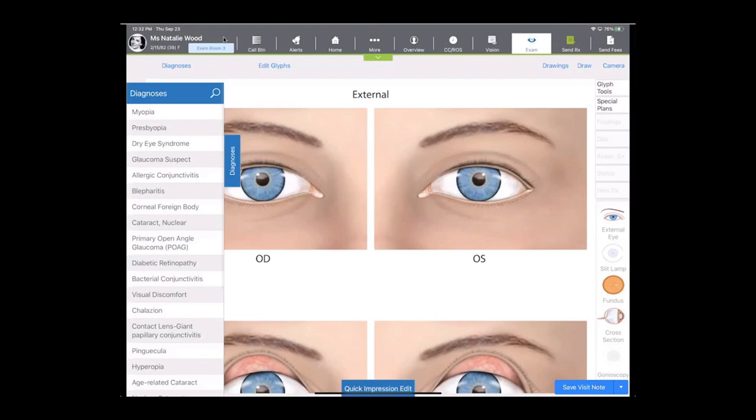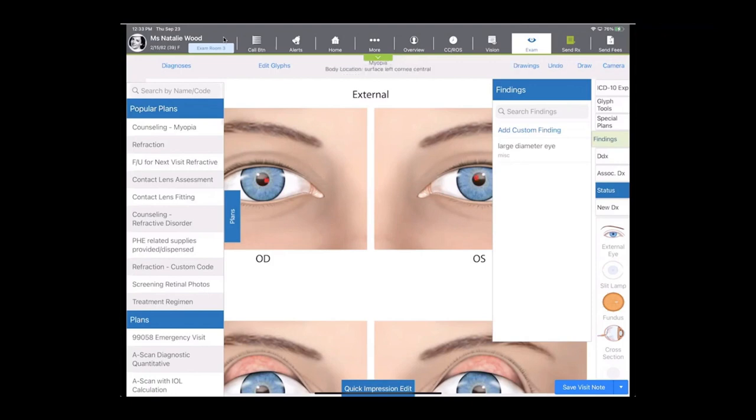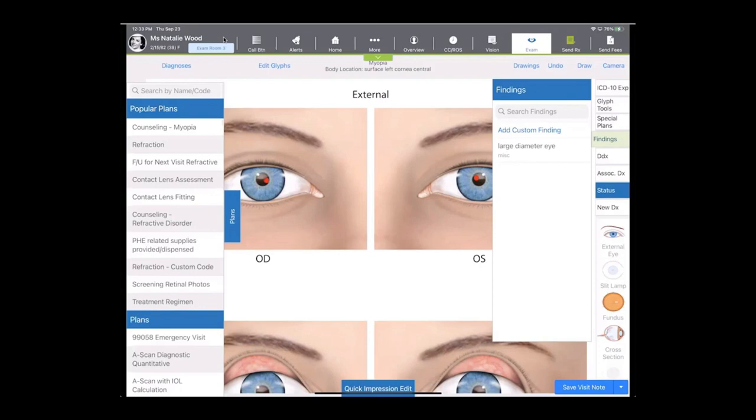I'm going to do a couple of things for you today. I want to show you the manual process, but then I also want to show you how we can even intensely expedite this using protocols. So if I was going to do a routine diagnosis today of myopia, I would tap on myopia, and I would tap on the eyes that it's applicable to. So I'm going to do the right and the left to code it as OU. And then you'll find again that popular plans, anything I've really ever used with myopia is going to come to the top of the list, and I can choose what I want to add to my documentation today. So I'll probably counsel, do a refraction, and see the patient here in a year.